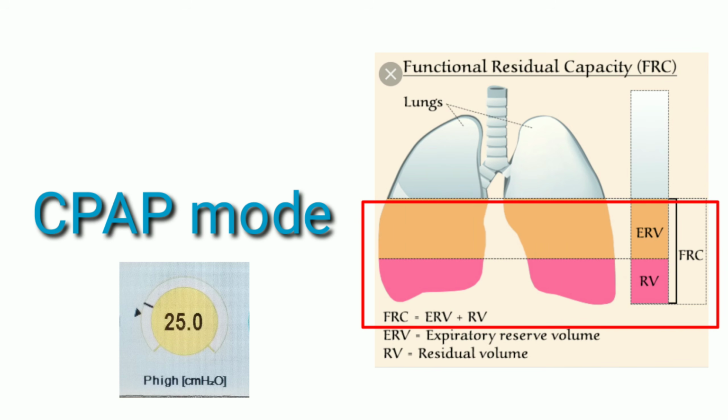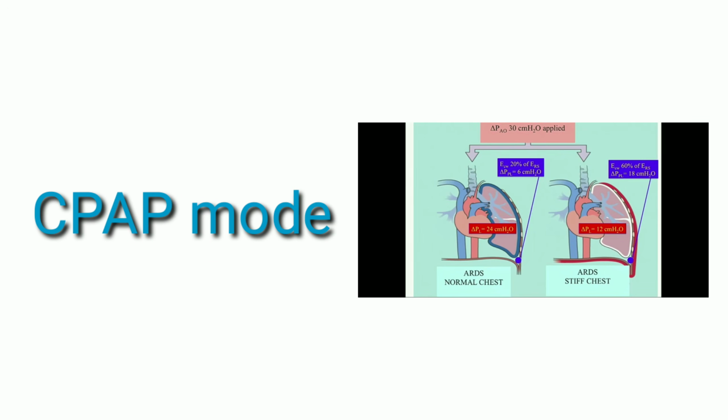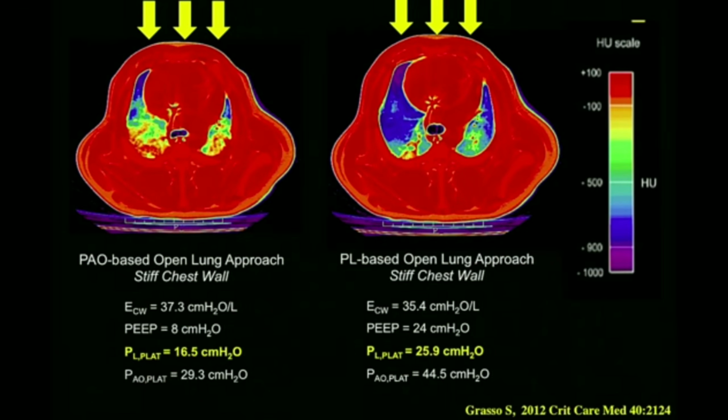We know that when a patient is sick or there's an altered chest wall compliance, we've got ascites, anything that will increase pleural pressure will create a negative transpulmonary pressure, where the outside of the lung has more pressure than the PEEP that we're setting, and obviously we'll get alveolar collapse.